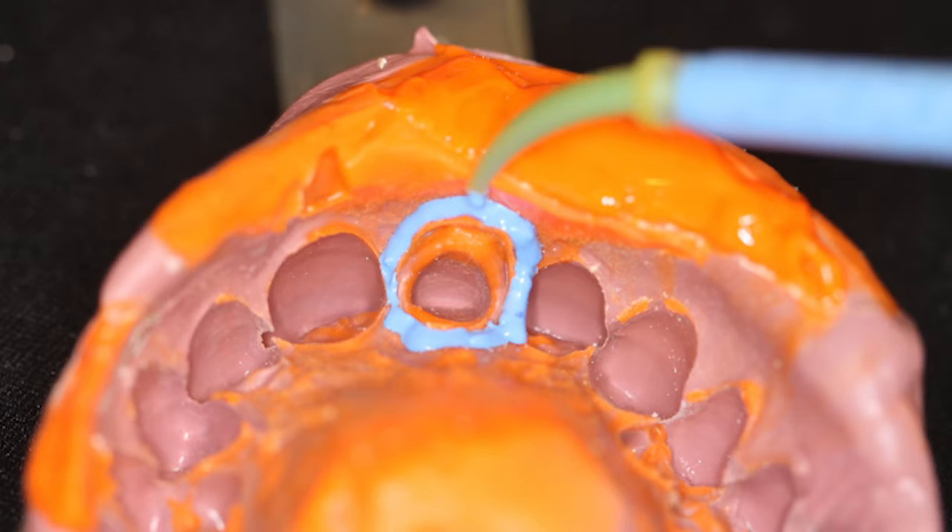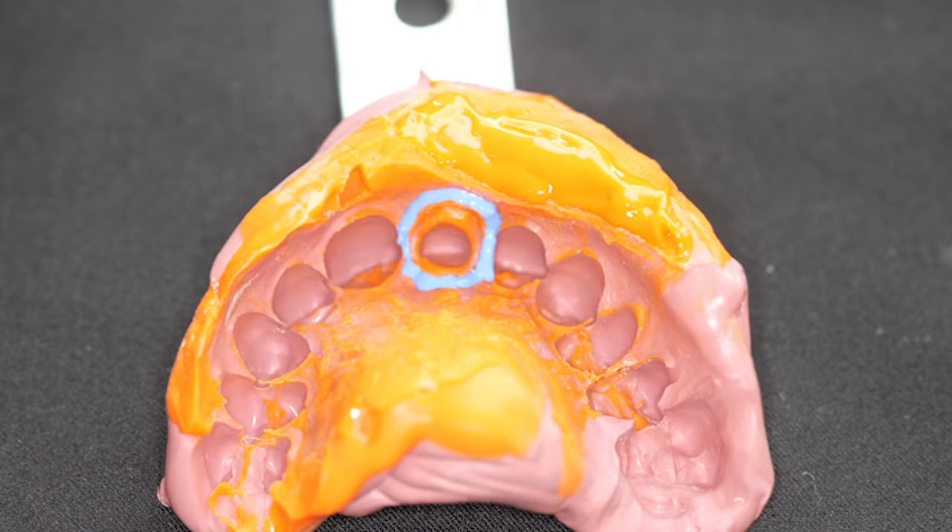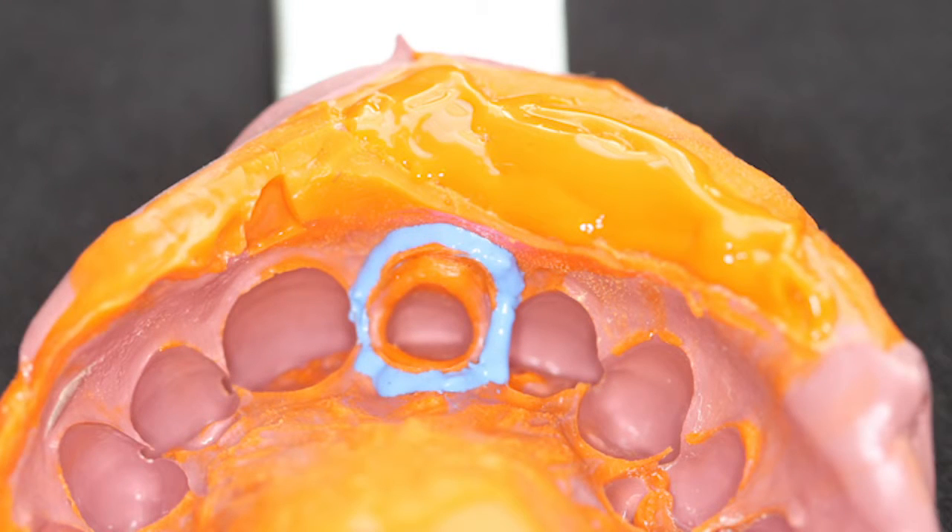What I'm doing is taking a different color impression material with a very fine tip, and I'll bead a very small amount of impression material around the margin on the outside. This works very, very well. You obviously have to use a different color material, otherwise if it bleeds inside the impression area it's going to be non-visible and you're going to distort your impression. But putting it outside, it stays there. You can tell what's what, and if a little bit of it drips inside for some reason, you can always go in and just remove it very carefully. You wait about 5-10 minutes, however long the impression material takes.